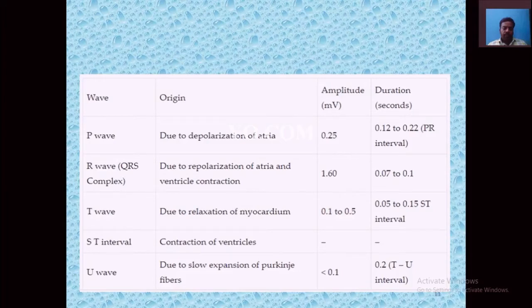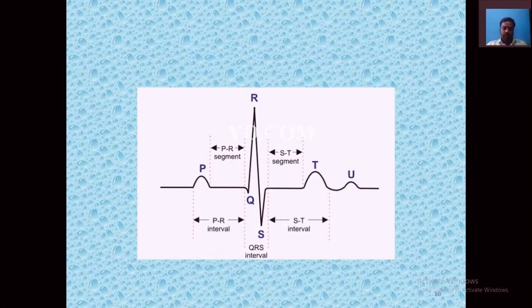Then the ST interval, that is contraction of ventricles. So here the amplitude is not mentioned, so actually see the ST interval. This is the ST interval, the amplitude is not considered.